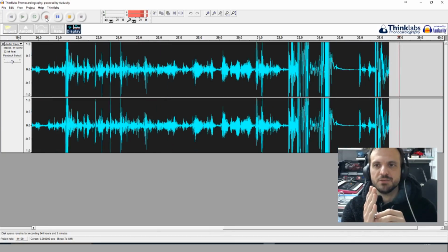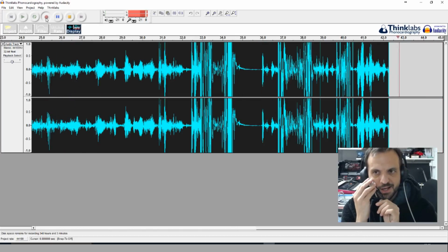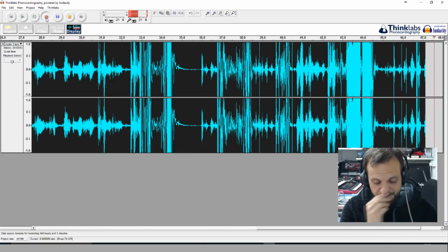It's picking up all those. And you might be able to switch it to this other mode and go around trying to listen to things like, can you hear your jaw working and stuff like that. So yeah, have a probe, have a play.